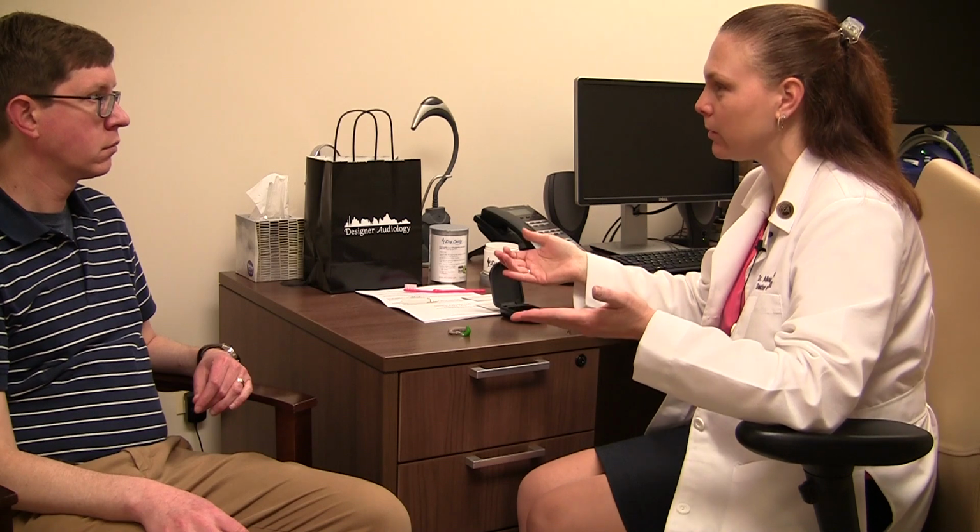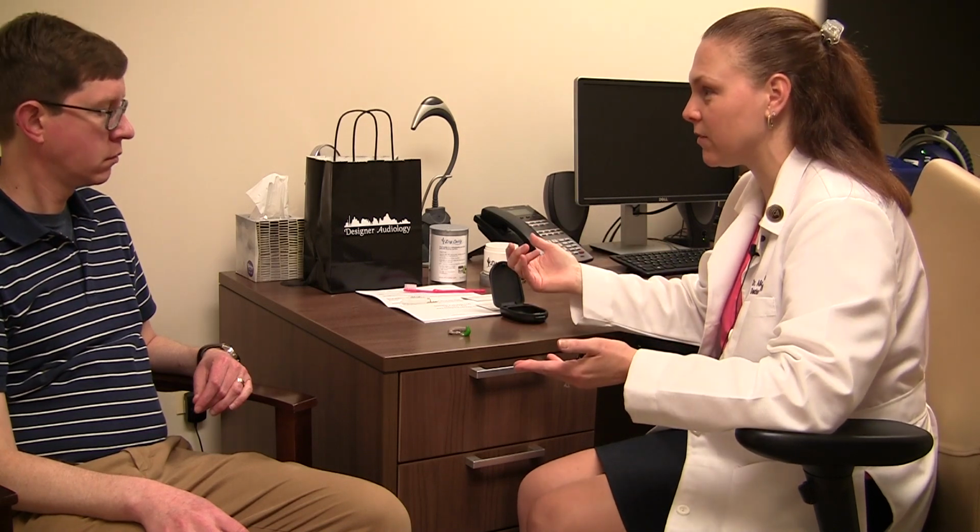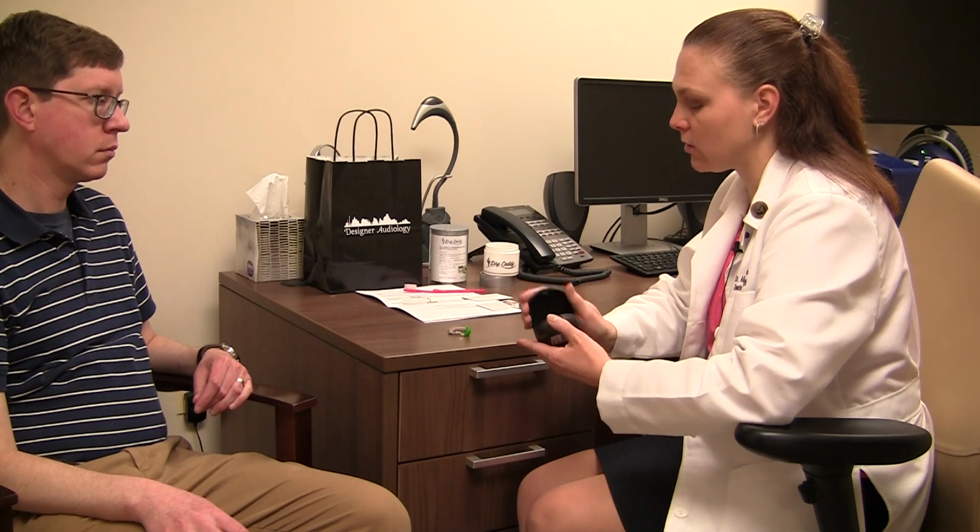The hearing aids can't get wet. No shower, no bath, no jumping in the pool with them on. If you're outside and it's raining or snowing, you're going to be fine as long as you go from point A to point B. But if you're going to jump in the mud puddles in between, take the hearing aids off. They give you this nice hard case that you can put the hearing aids in.